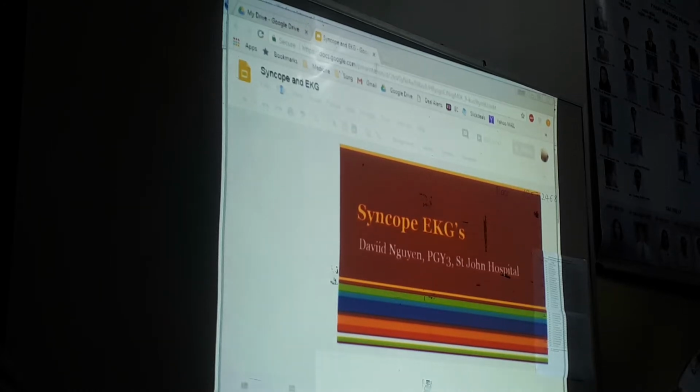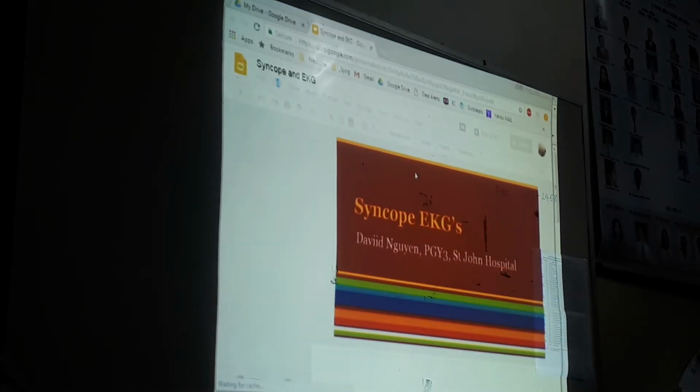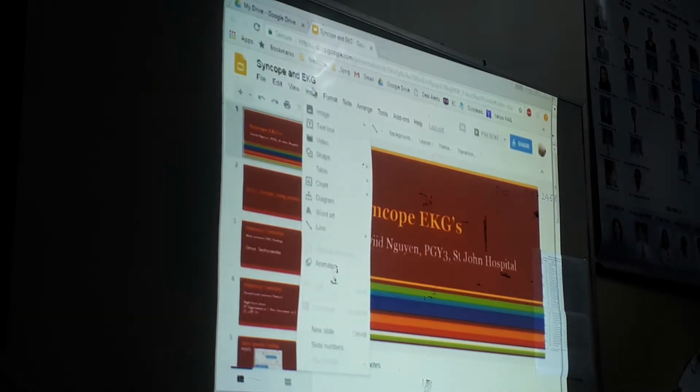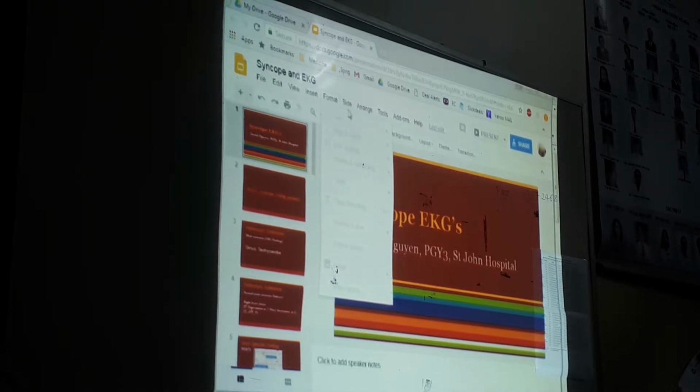Why is this not working? Oh, loading. And who's good at reading EKGs? Anybody here? We're gonna do some reading of EKGs. I'm gonna let you guys try first. If you get stuck, you can ask your professor.